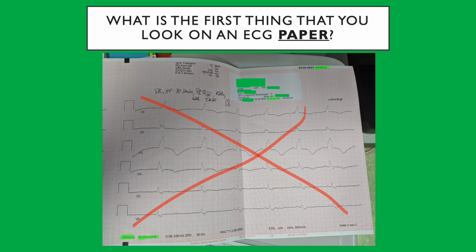Also, there is a lot of ECGs for one patient, right? And they just put them in the box, so maybe they get twisted around. A patient who is getting worse, like the next ECG is worse than the first one, and the third one is worse than the second. If you put them on the other way, you'll say, this guy was worse, but now he's getting better. So if you read it on the opposite side.